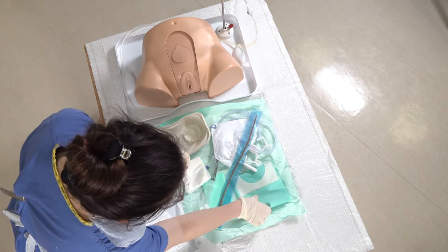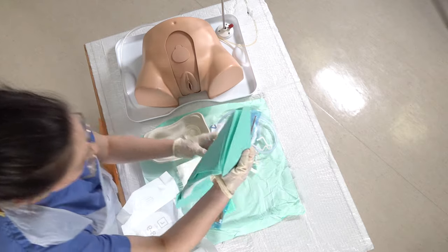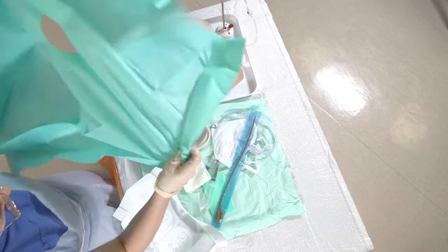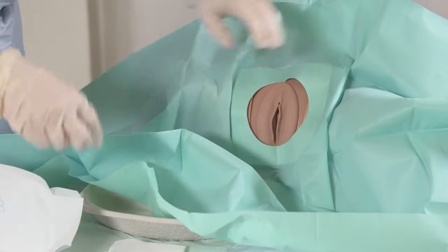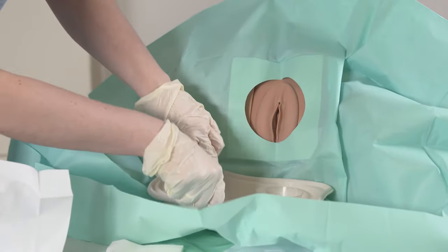Okay, so we have a sterile drape that we can place over the patient's legs, which has a hole in the middle, and then placing our kidney dish on top of that drape in between the patient's legs.